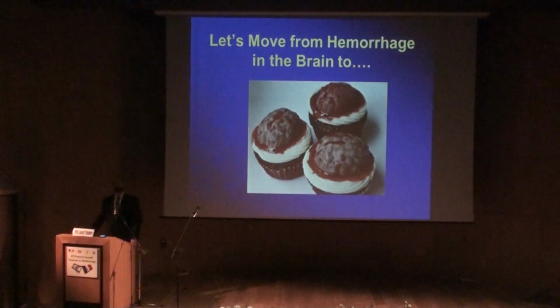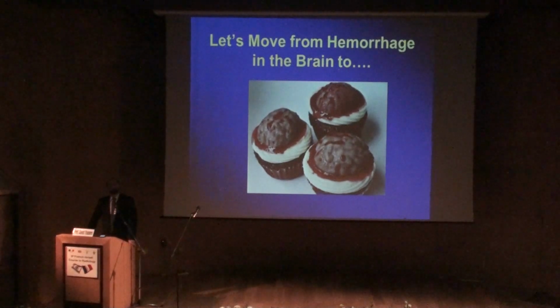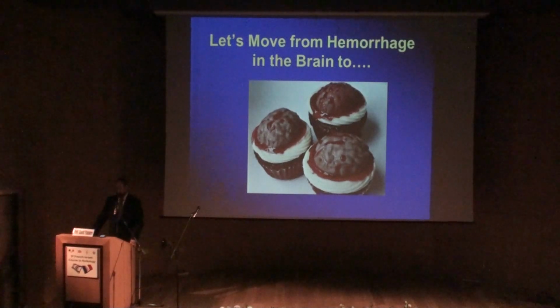So I focused mostly on hemorrhage, and now I'd like to talk about the other roles of susceptibility weighted imaging, particularly in research.